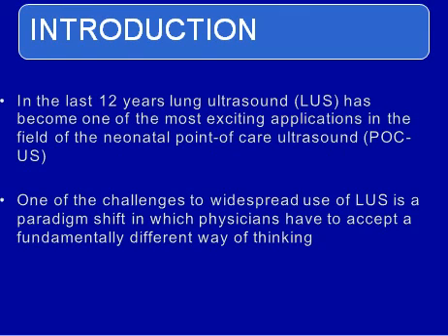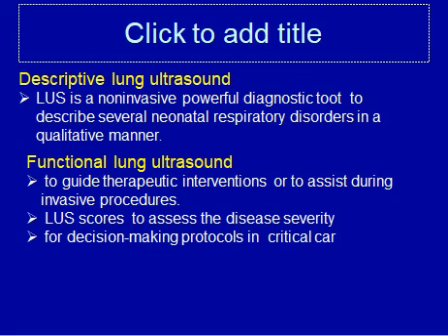In the last 12 years, lung ultrasound has become one of the most exciting applications in the field of neonatal point-of-care ultrasound. One of the challenges to widespread use of lung ultrasound is the paradigm shift in which the physician has to accept a fundamentally different way of thinking. Why lung ultrasound?